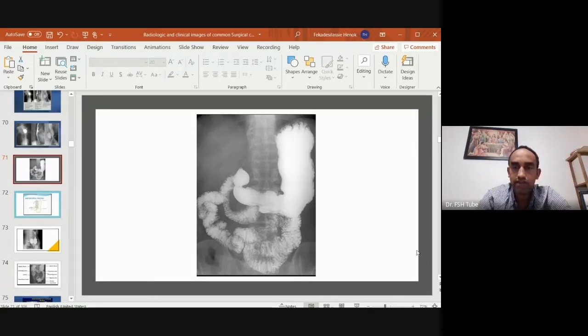Okay, that's fine. So this is the stomach. Most of the time people used to do this for any gastric and upper GI pathologies. It could be PUD, malignancy, or ulcer lesions. Thanks to the advent of upper GI endoscopy, most people do not really do this anymore. You go ahead and do upper GI endoscopy. Whatever pathology you are dealing with, you can diagnose with upper GI endoscopy.